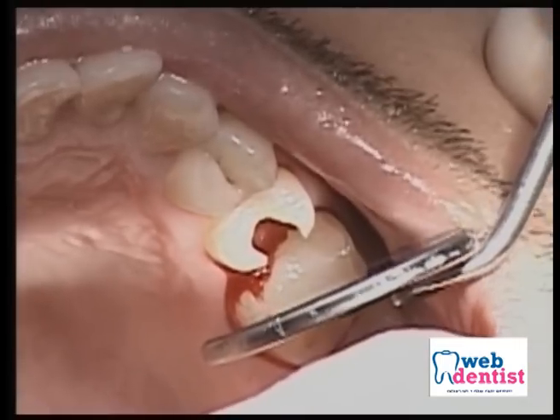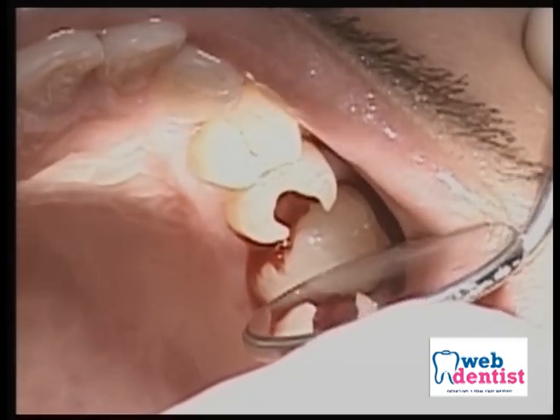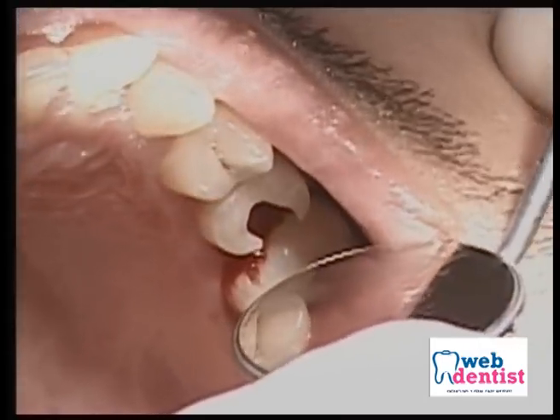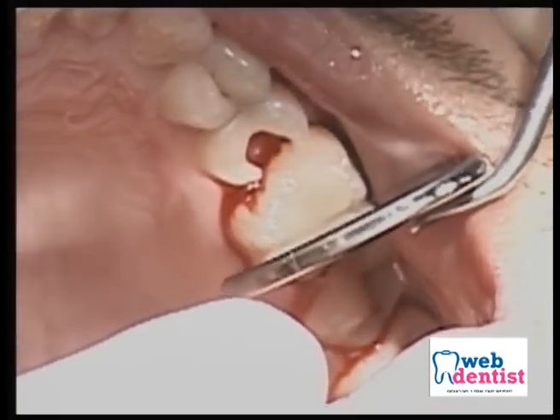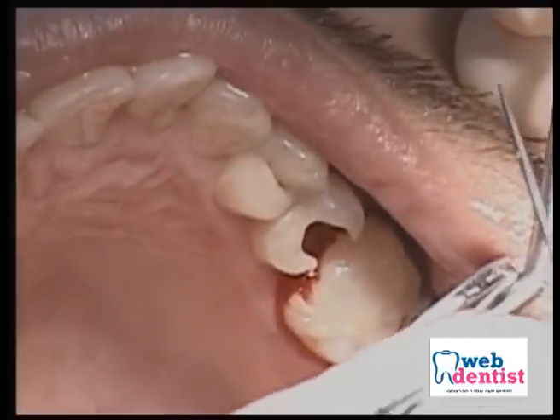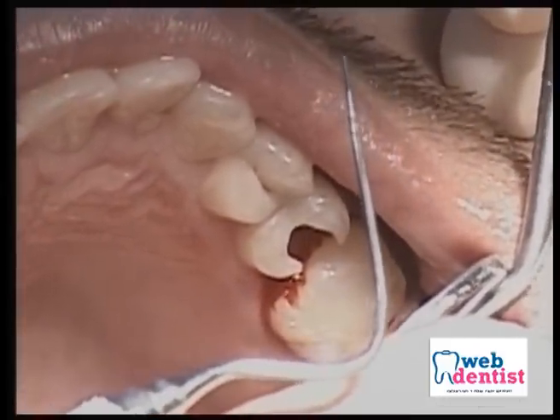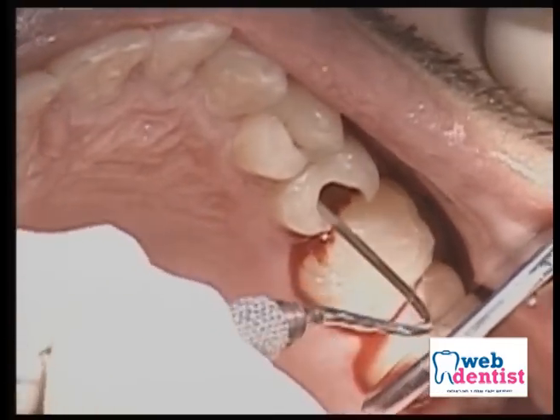The first part of the access cavity is the coronal access, and the second part of the access cavity is the radicular access, that is access to the roots. I have prepared the coronal access. Now I will check for the radicular access. The endodontic explorer is a modification of the normal explorer. It is an elongated instrument, and this helps me in locating the orifices.